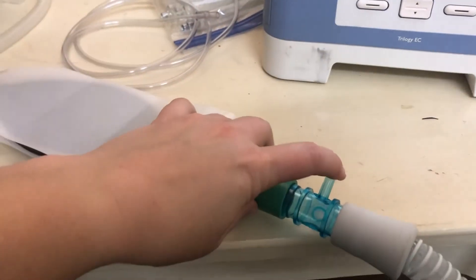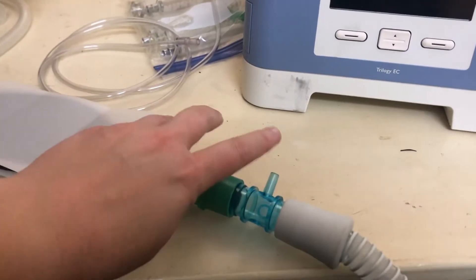The machine is calibrated for that passive exhalation. So if you accidentally close this port, your patient is unable to exhale and you will have trouble with high CO2s.